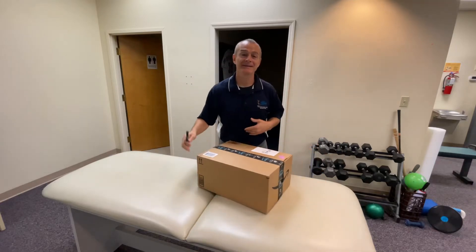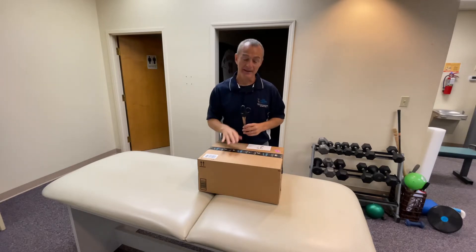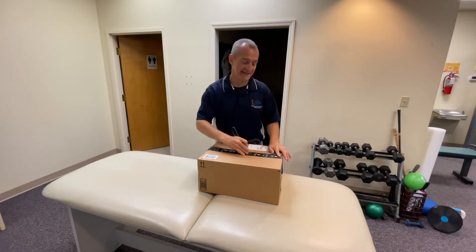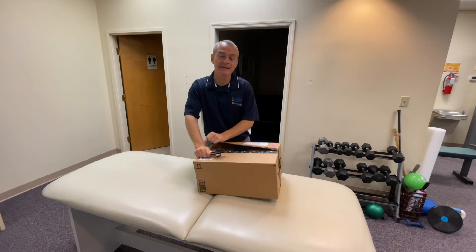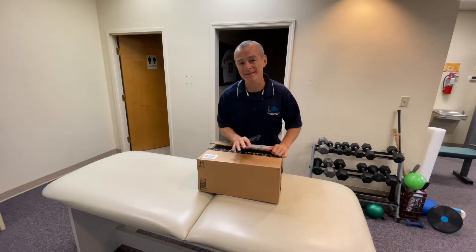Good morning guys, Tony Maritato here. In today's video I'm unboxing a shoulder sling with an abduction pillow. I purchased this on Amazon over the weekend. I've been really excited to get it here in the clinic because I get a lot of patients who are planning on having rotator cuff repair surgery but they've never worn a sling.